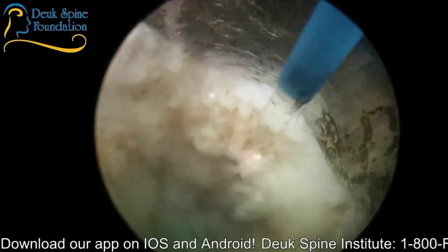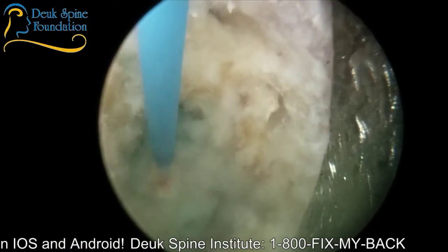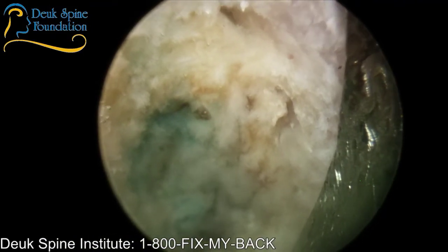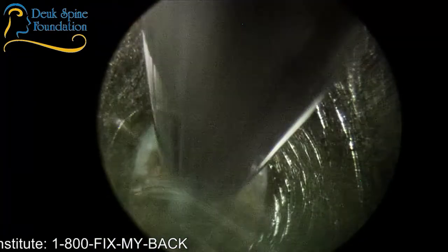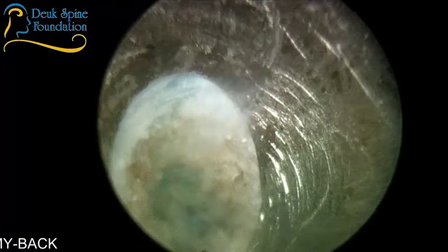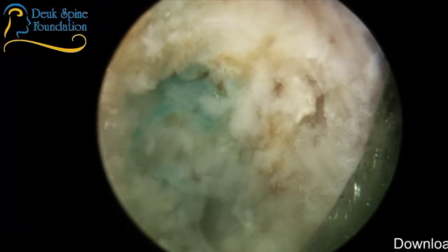It's like a colonoscopy from the standpoint of the anesthesia. You don't have a tube down your throat. It's all done with sedation. We call it MAC. Basically, IV sedation with propofol. It's good stuff. Keeps you asleep, comfortable, nice dreams. And when you wake up, it's all done. Laser. I've got about 2 minutes left.